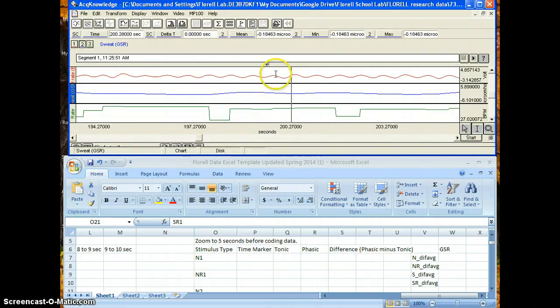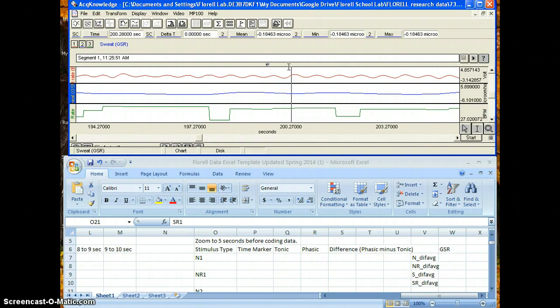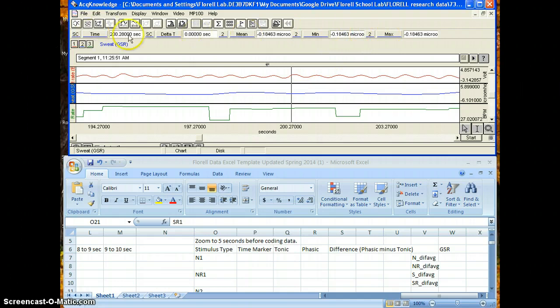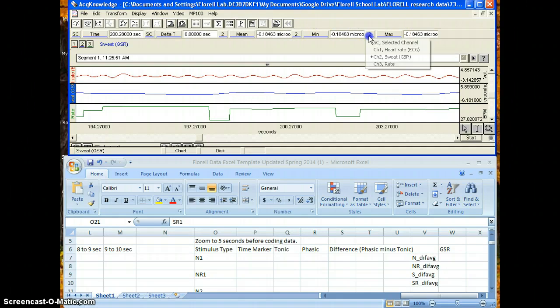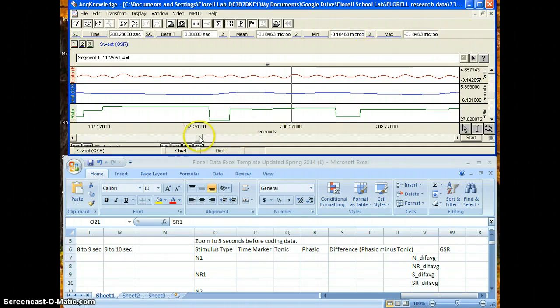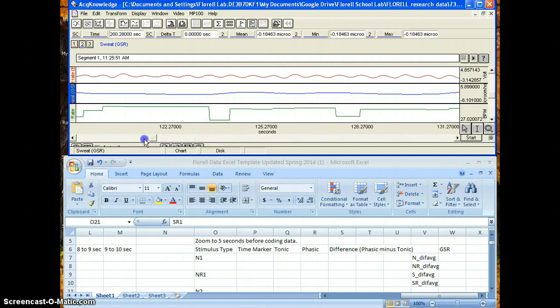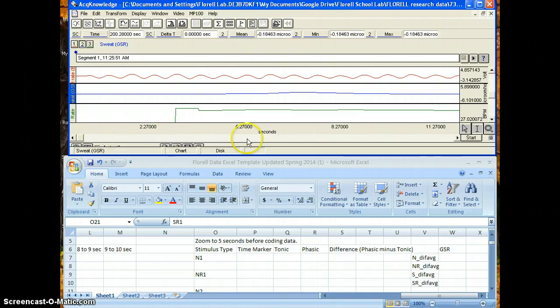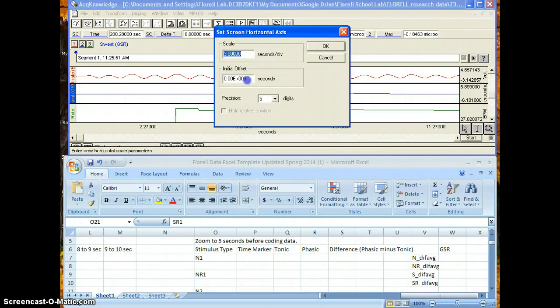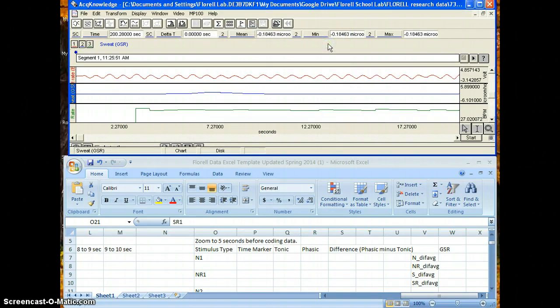So in order to do GSR, you need to make sure that this is on min and max. These don't really matter to us right now. We just need to make sure this is min and max and that they are on channel 2 and they are blue. And in fact, they are on min and max. So now you need to scroll over to the beginning and click on seconds and then zoom to five seconds. That just helps smooth out the GSR data, which is the little blue line.